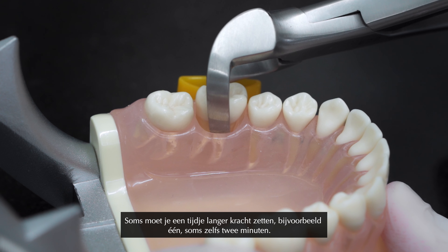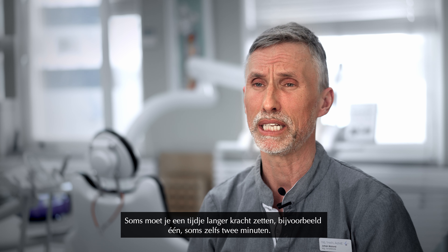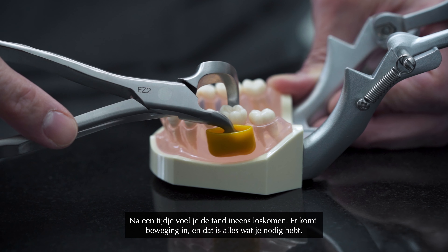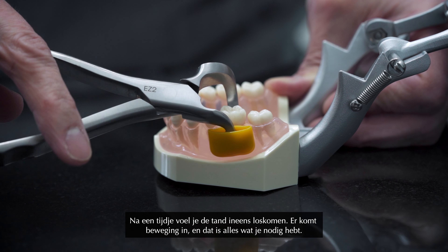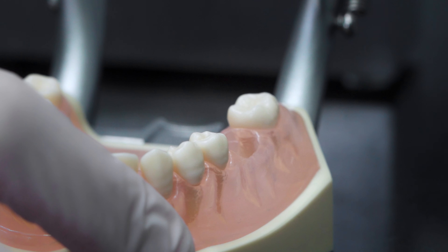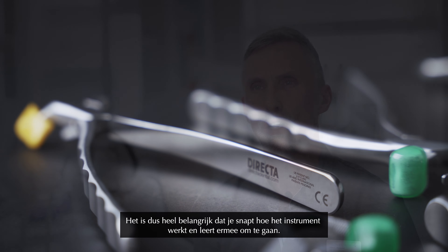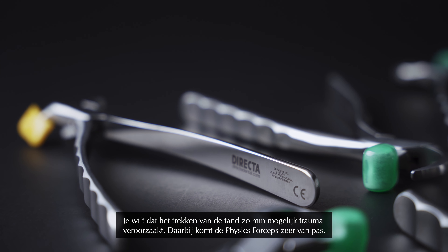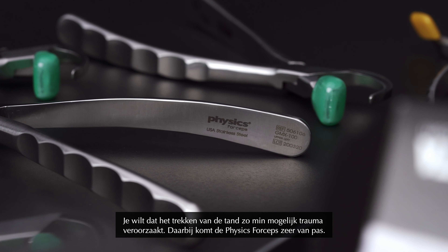Sometimes you have to apply the force for a much longer time than you think — one minute, maybe two minutes — and then all of a sudden you feel the tooth like popping. It starts moving and that's all you need. It's very important that you get to know the instrument and learn how to use it. You want to take out the tooth as atraumatic as possible, and that's when the Physic forceps is very useful.